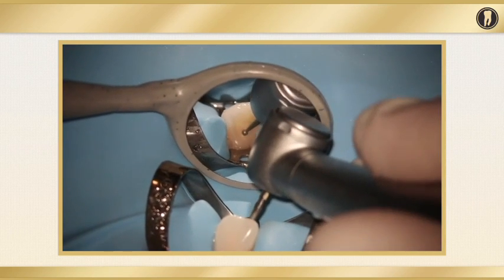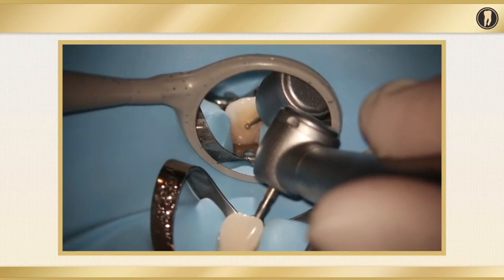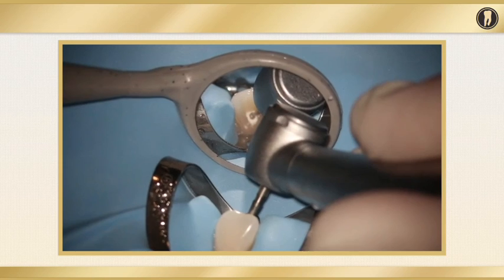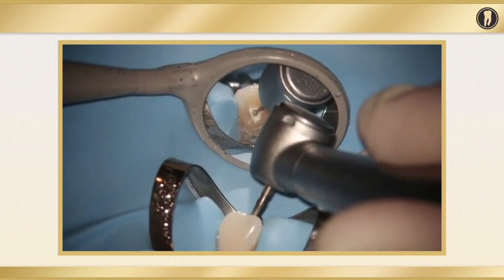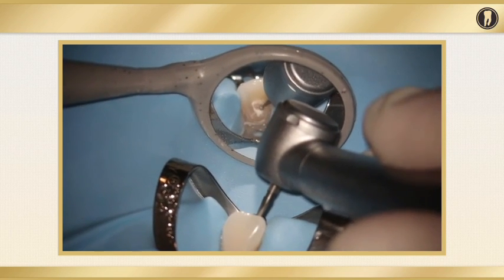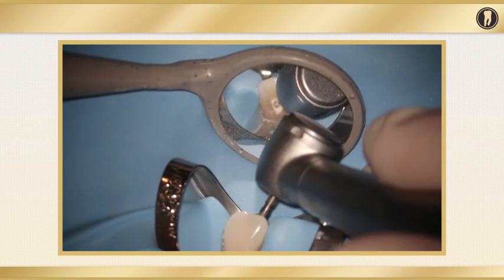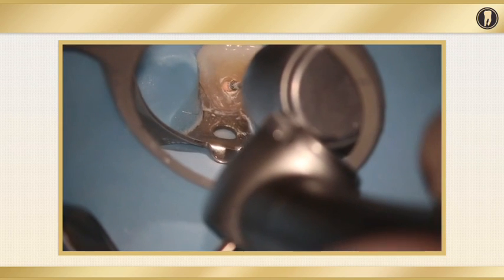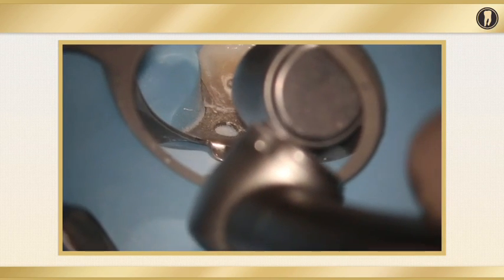In this case, it was a retreat, so it was not as difficult, but the same principles apply to your access. So I have the water, I'm turning the water off now, and then I'm going to have my assistant clean the access prep by washing and drying it out, and then I'm going to go back in and access and penetrate the pulp chamber with the number 2 round diamond. Again, you could also use a 330 long carbide burr to do this.